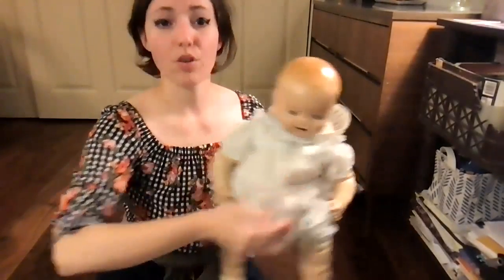That's your first pad that goes like that. There's pictures on the AED, sorry for the confusingness. So you're gonna place the first pad here and the second pad here. Left side of your chest is where your heart is, and you're drawing a line between those two with the pads that you're placing.